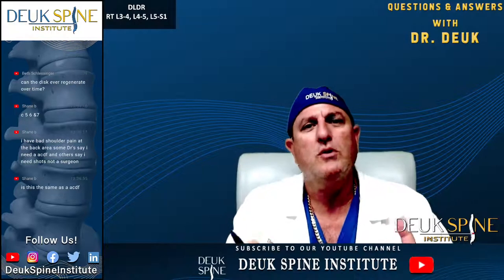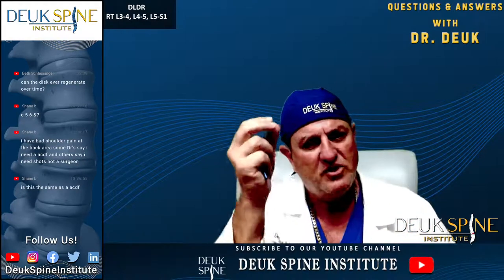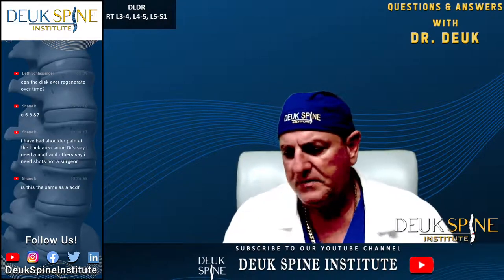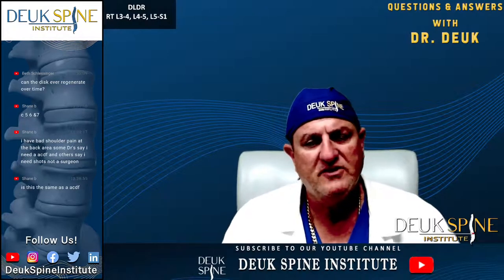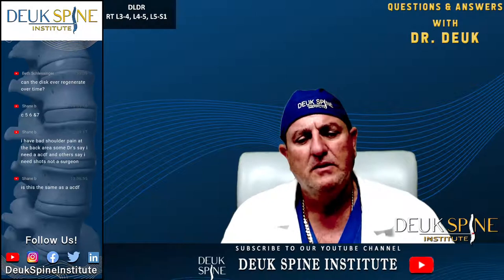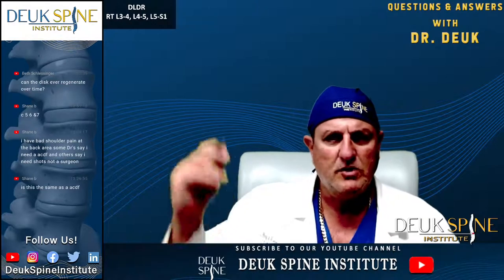And that's why I joke around sometimes and I say, don't try this at home, because the way I do it, it looks easy. But if you're off by just 1 or 2 degrees, you can actually hit the kidneys, or you can hit the aorta, or you can hit, you know, the intestines, which will be really bad because you'll puncture the colon or the small intestine, and then the patient will become septic and they could die. So you're right, you have to worry about those things, but if you learn the technique and do it right, which I do obviously, you won't hit any organs.